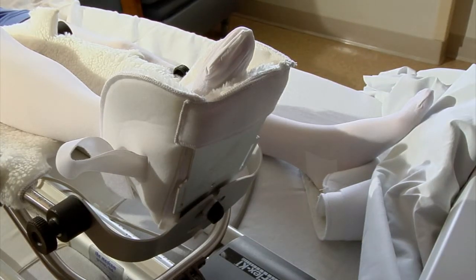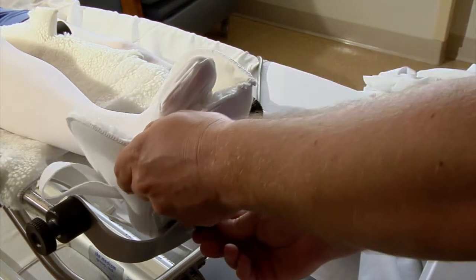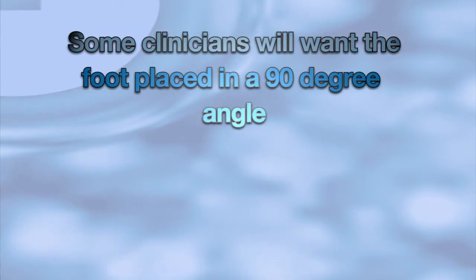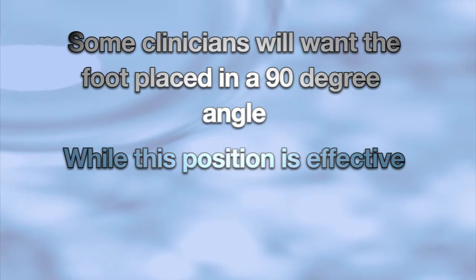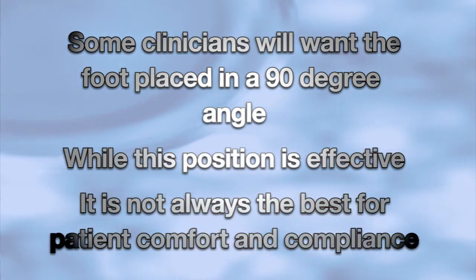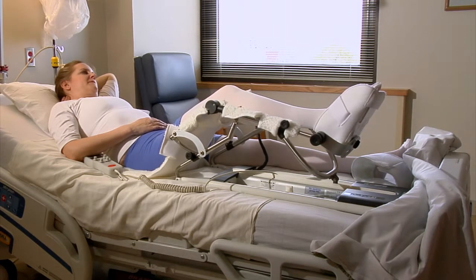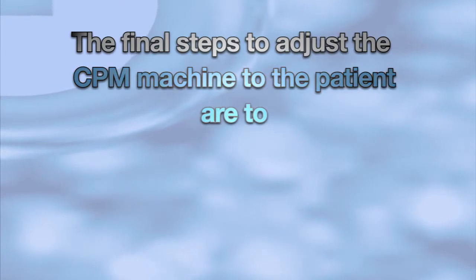Usually you can get a good idea for this adjustment by looking at the natural resting position of the patient's contralateral or non-affected foot. It's important to note that some clinicians will want the foot plate adjusted so that the patient's foot is placed in a 90-degree angle. While this position is effective, it's not always the best for patient comfort and compliance. Keep in mind that our goal is to comfortably bend the patient's leg so that they receive the full benefit of the CPM therapy.